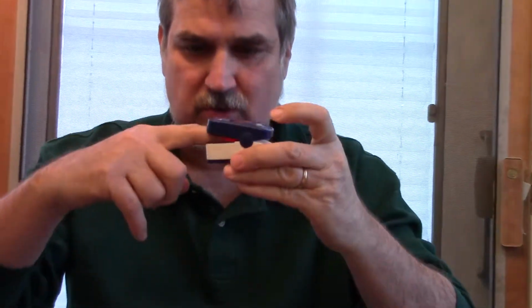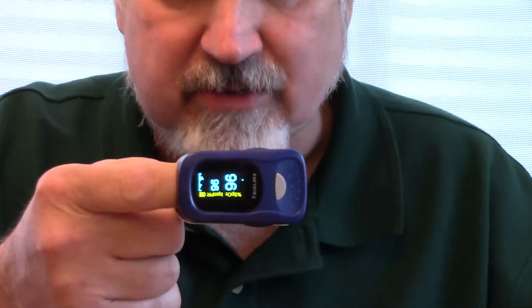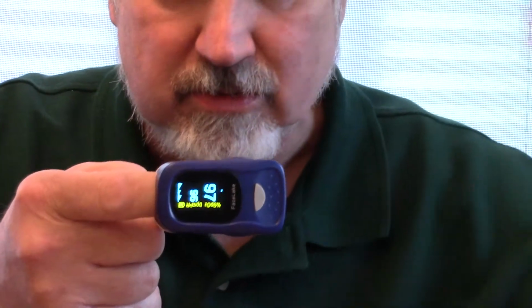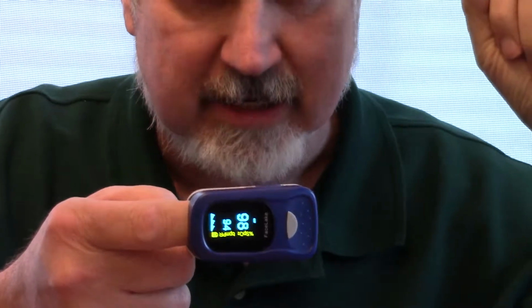So let me show you how to use an oximeter. First of all, you turn it on, like that. Then what I do is place my finger, the whole length of my finger, into the first part of the device. And then as you can see, you hear the pulse. It's a regular beat. Doot, doot, doot, doot, doot. If you don't have that, it is an inaccurate reading.